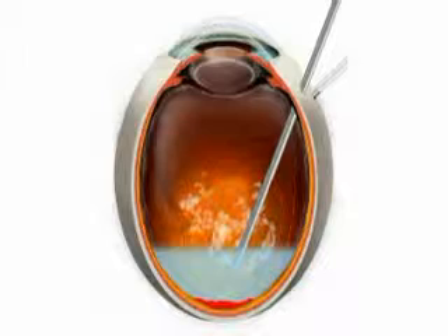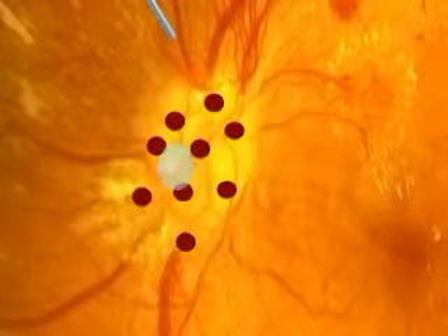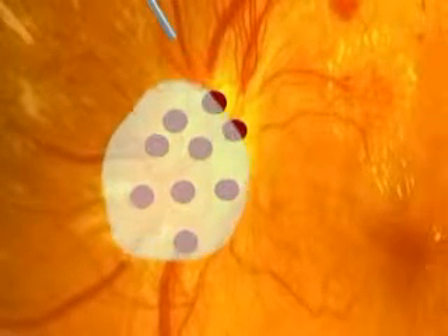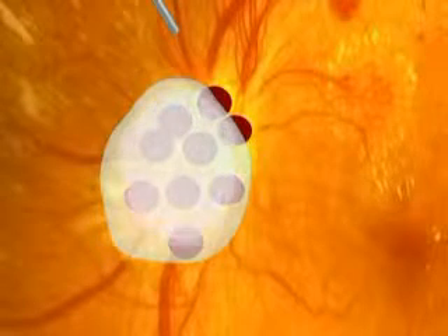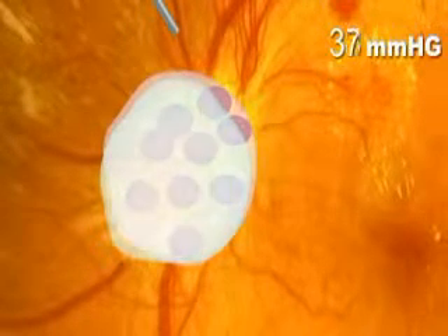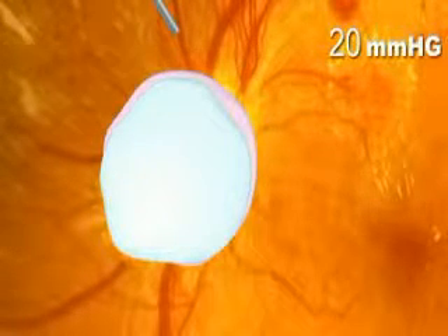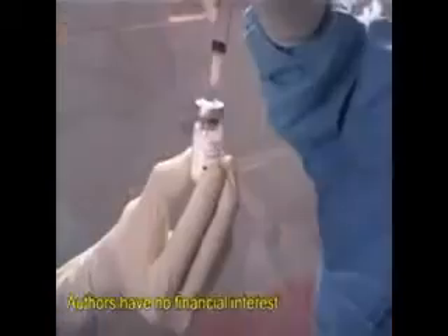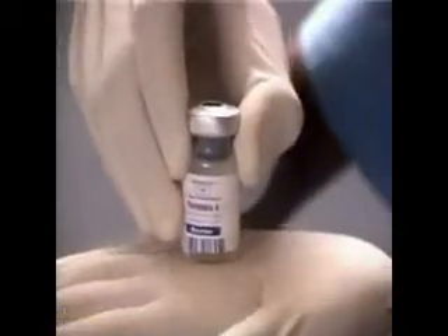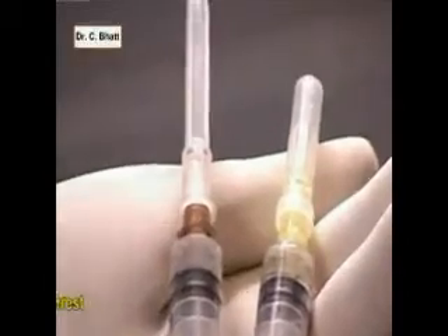Here we have used fibrin glue as a biological adhesive under air to stop disc bleeding. Fibrin glue is prepared from human fibrinogen dissolved in bovine aprotinin and thrombin in calcium chloride. When the two solutions mix, fibrin monomer is precipitated, simulating human coagulation and forming a reticulum which acts as an adhesive and stops the bleeders from the disc.